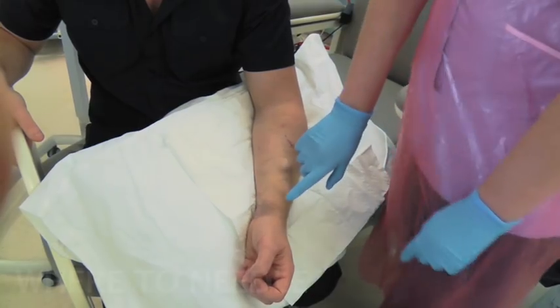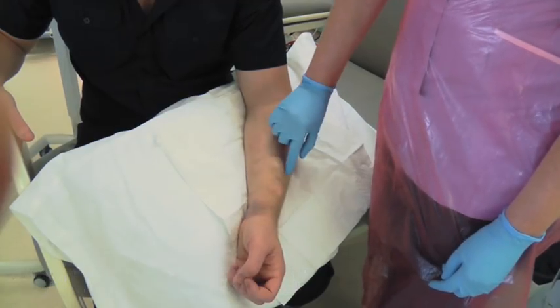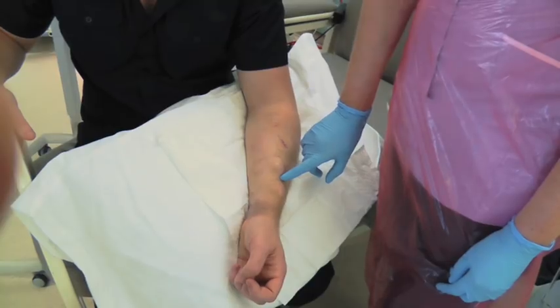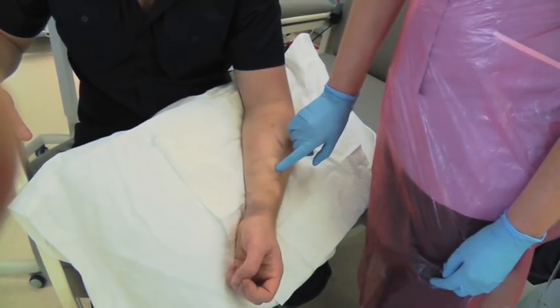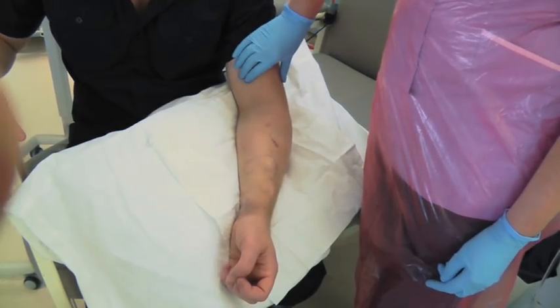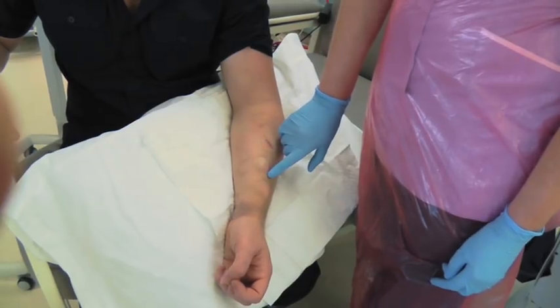This patient has aneurysms on his fistula which are caused by bad needling and doing area puncture. If you are going to buttonhole, you shouldn't buttonhole or even needle into this. He has got plenty of other places up his arm that could be needled and you should never needle directly into an aneurysm.